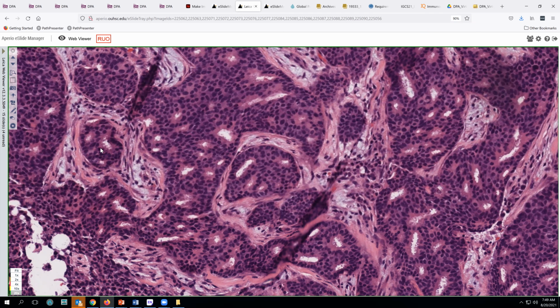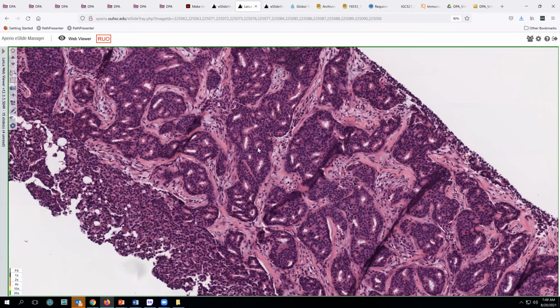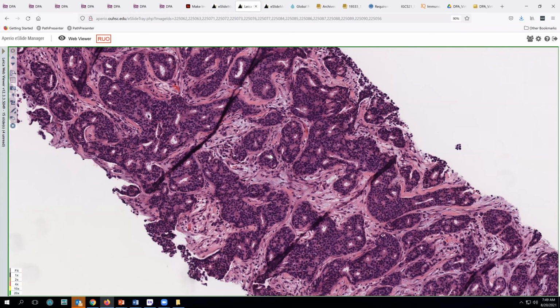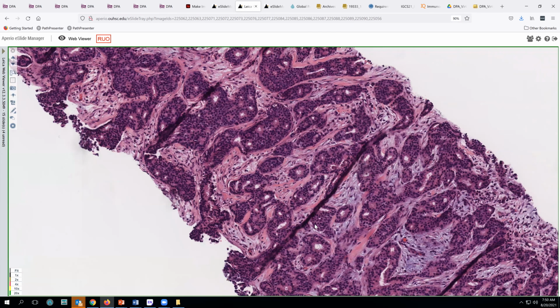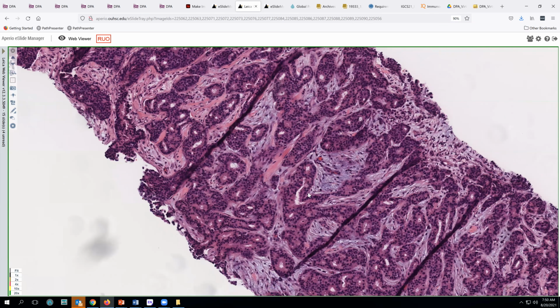But there's just something about this that looked a little bit funny and different than some of the other tumors. Is this an invasive cribriform carcinoma, or could this be an adenoid cystic type tumor? So adenoid cystic carcinomas of the breast are quite unusual, but because they have a very different response profile, it is important to recognize them at biopsy, if at all possible.